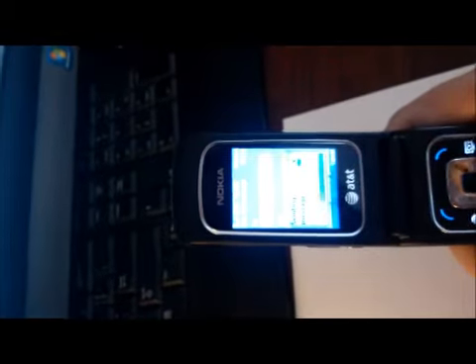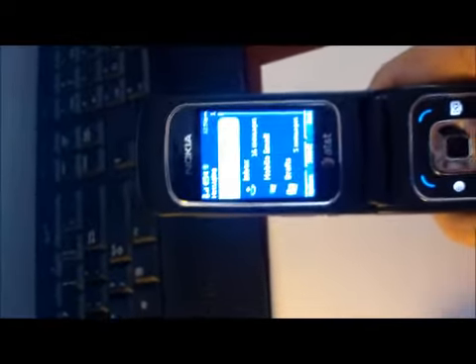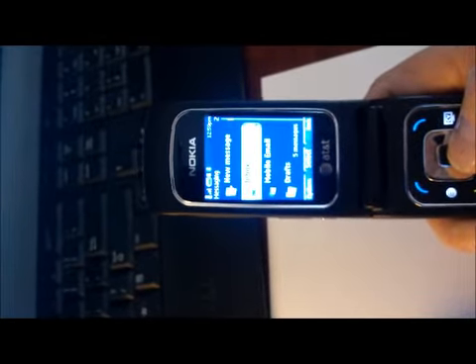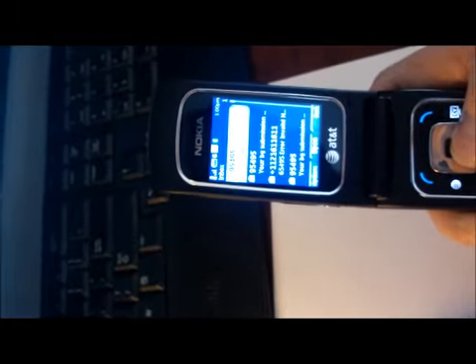and I'll just send it again. And what it will do, it'll go back to the database again and retrieve the messages, and we'll be able to see what the various trends are. And it can be done in graphical form, or it can be in a variety of forms. So here we go. There it is. And it goes back now and says, here's the blood glucose measurement.